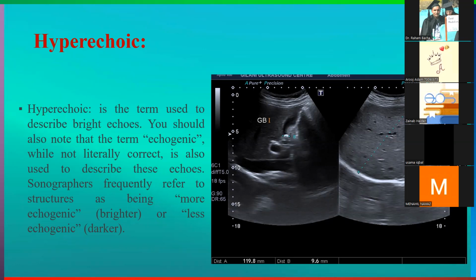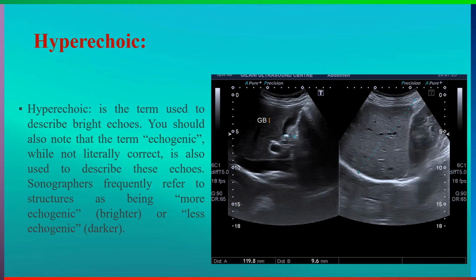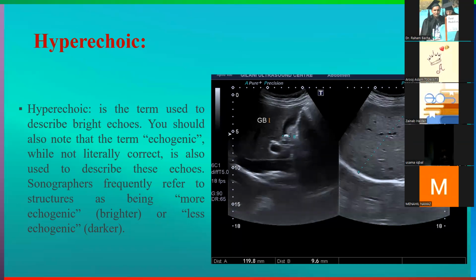So if you select a specific database, for example, you are evaluating the liver, the machine will have a number of images in its database, and the liver which you are evaluating will be compared with the database, and the machine will tell you whether the liver is hyperechoic or hypoechoic or isoechoic, right? And in that case, that will be objective, and objectively, it will give the same result to either a novice examiner or an expert examiner.